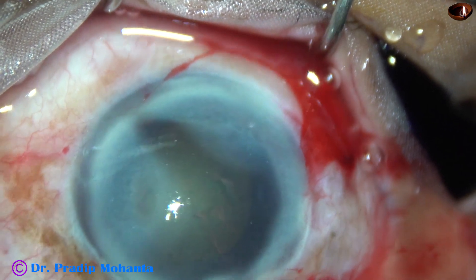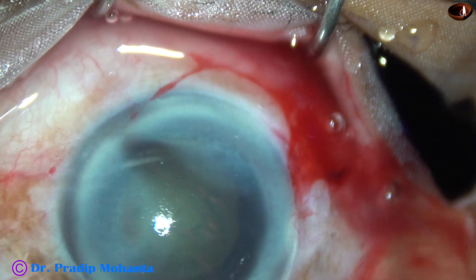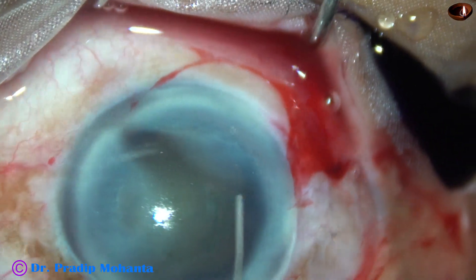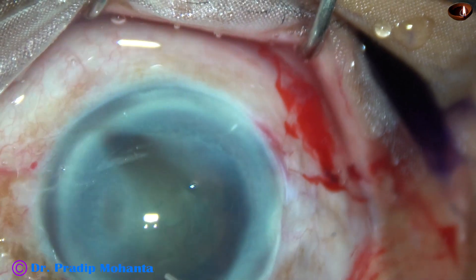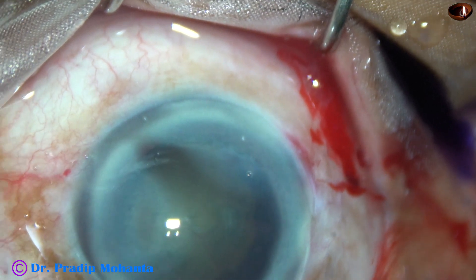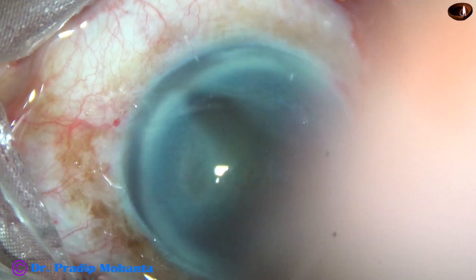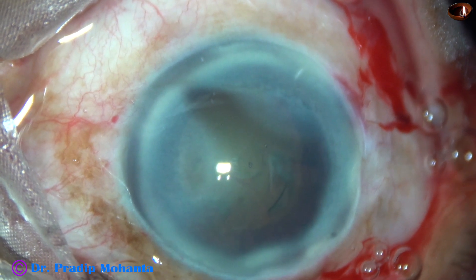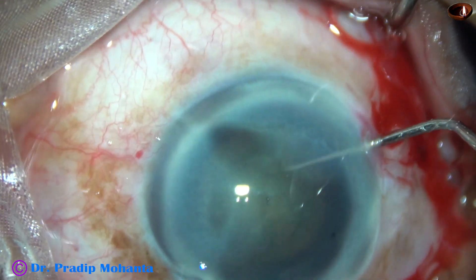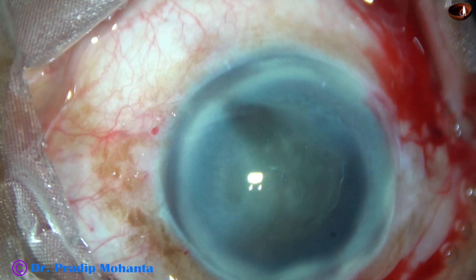Now hydrodissection is done — some amount of visco is expressed out and then very gently hydrodissection is done. The nucleus is tapped and then the nucleus is rotated. In this case I am going to rotate the nucleus bimanually using two Sinski hooks, that will cause less stress on the zonule. Both clockwise and anticlockwise rotation has been done.